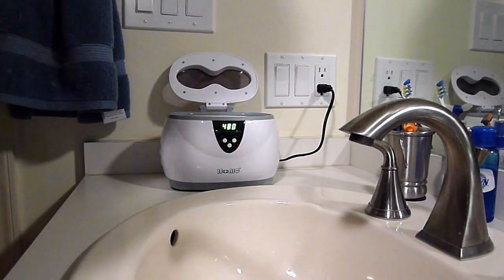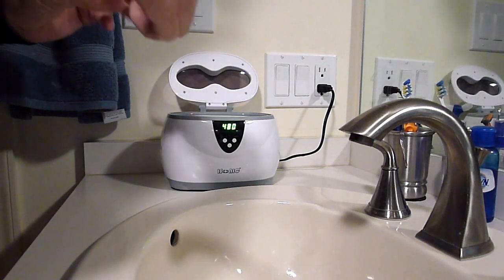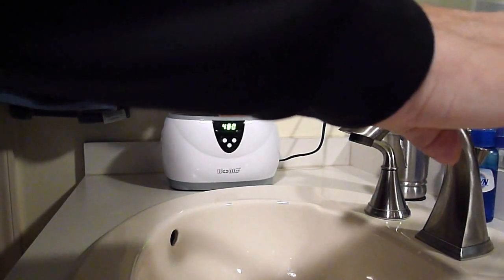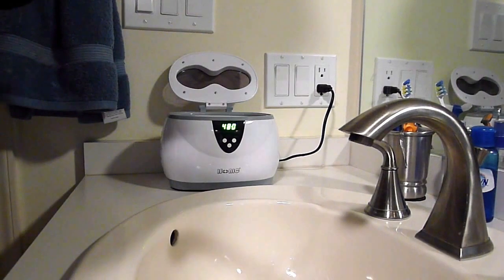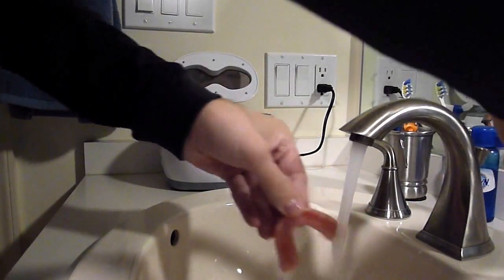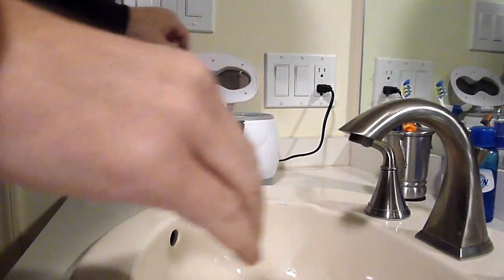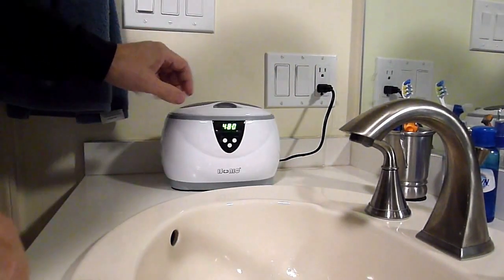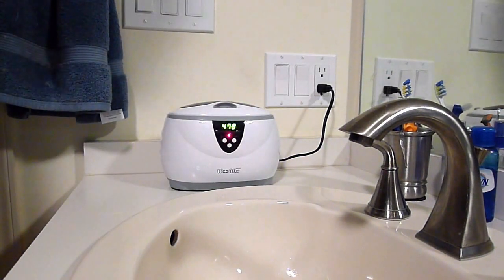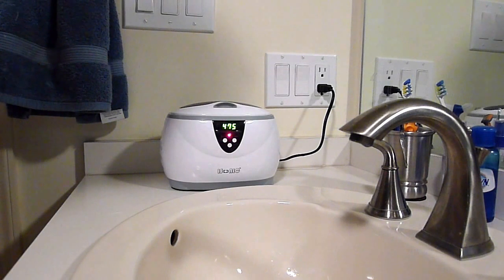Quick rinse there, then turn it on and let it cycle through.